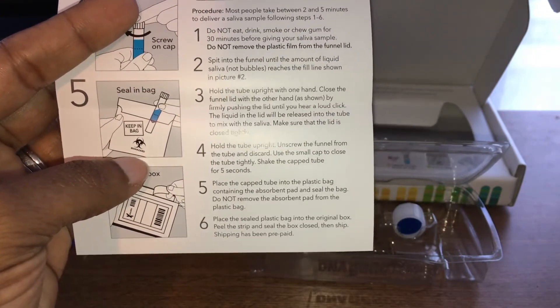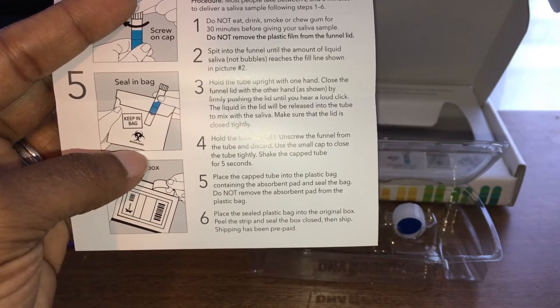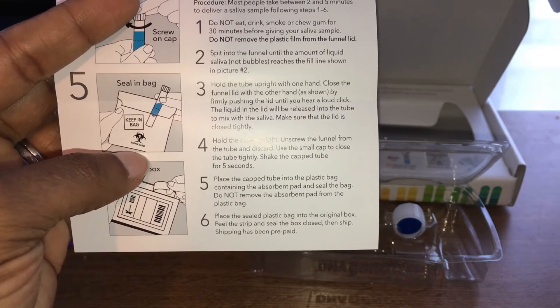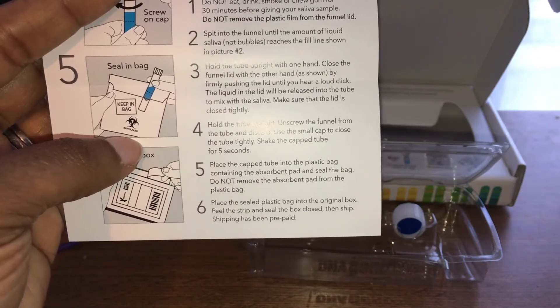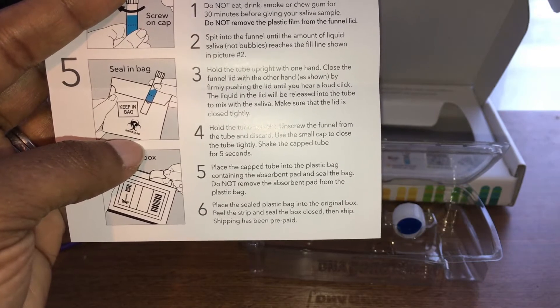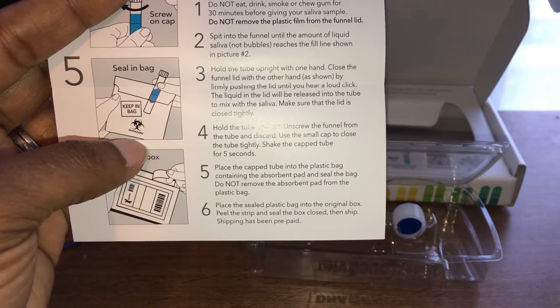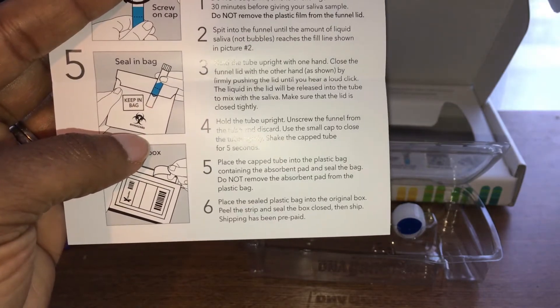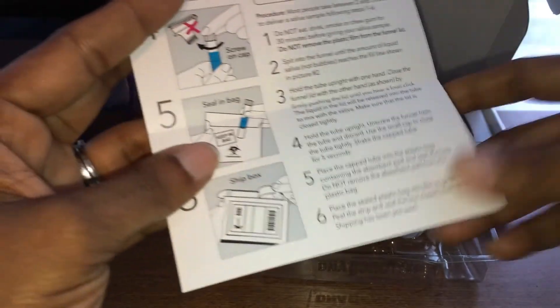Place the tube into the plastic bag containing the absorbent pad and seal the bag. Do not remove the absorbent pad from the bag. Place the sealed plastic bag into the original box, peel the strip, and seal the box. Shipping has already been prepaid.